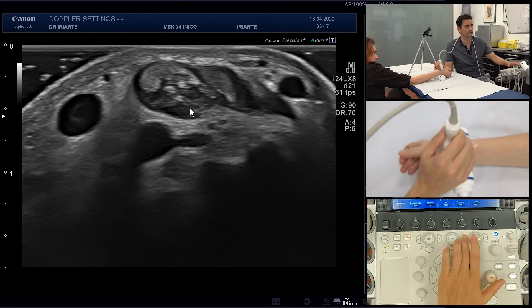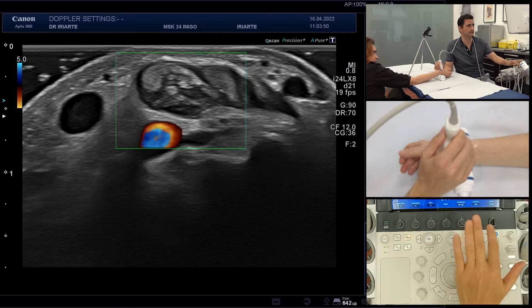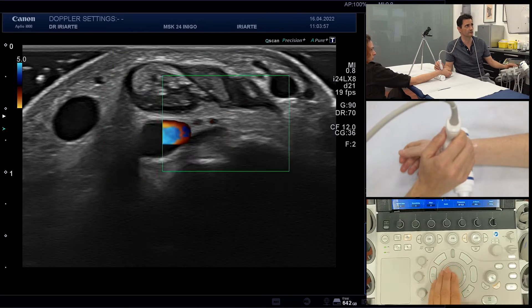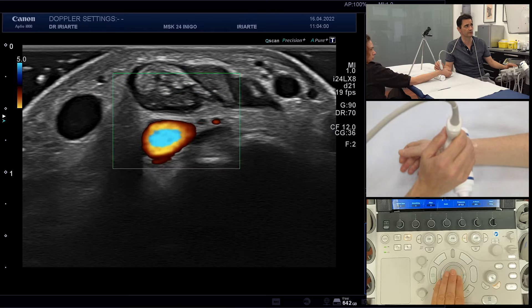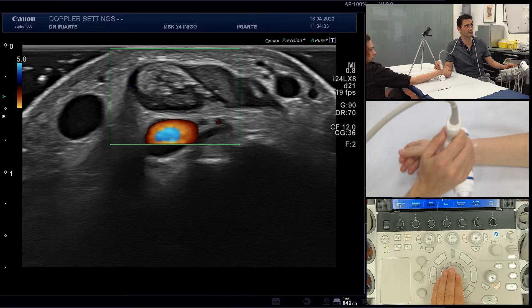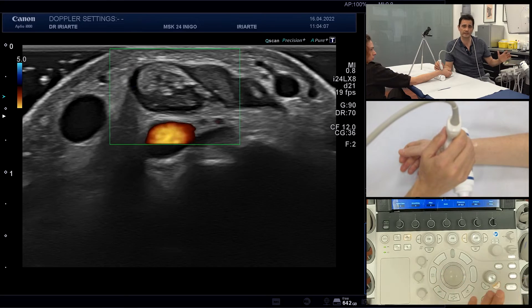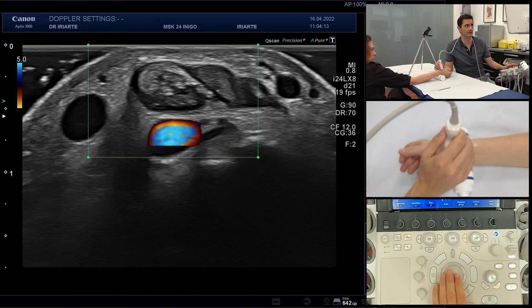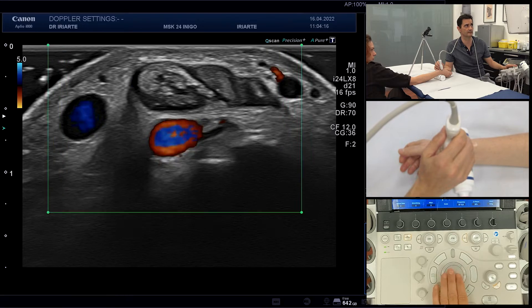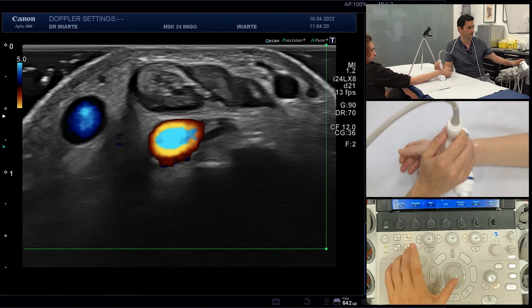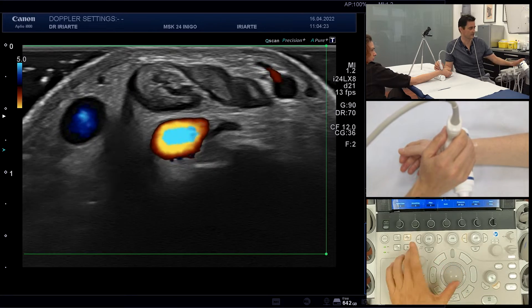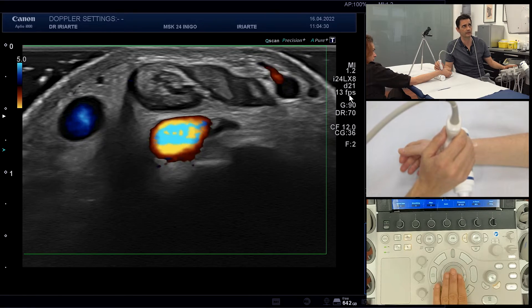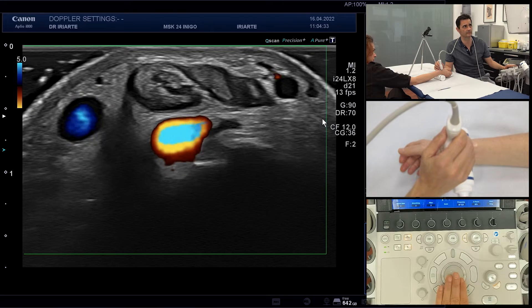We are going to activate power Doppler. The first thing is that we have this green Doppler box, and we can move the Doppler box with our trackball to locate it in the area we want to examine. The second thing is that we can manipulate the size of this Doppler box — we can make it bigger, but as we do, the frame rate will decrease.